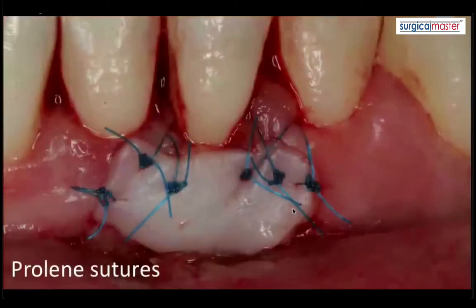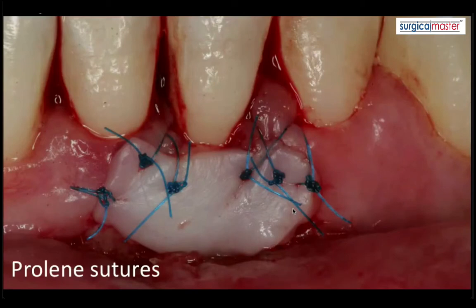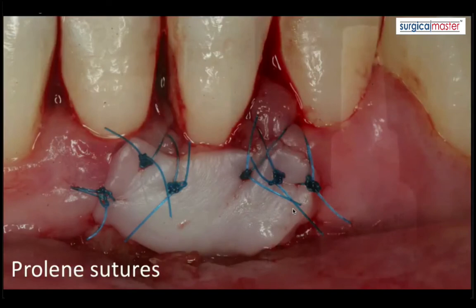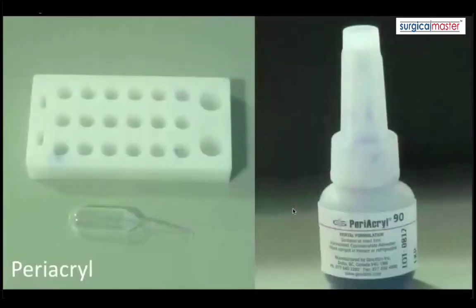We suture the graft with interrupted sutures on the coronal part — I use prolene 6-0 — suturing only to the attached tissue. In this case, only five or six sutures. Don't suture the apical part, because the mucosa will pull on the graft, so it's not necessary. Some finger pressure, and then the secret sauce.